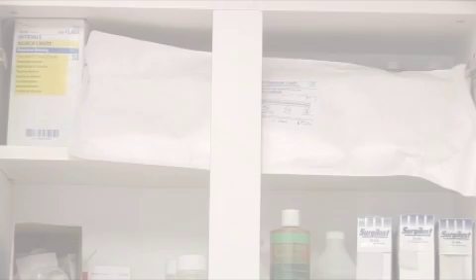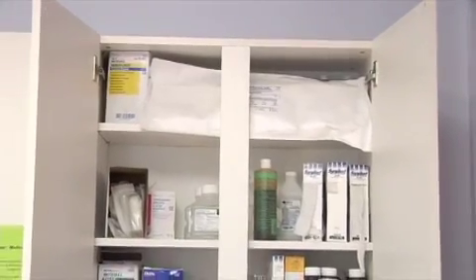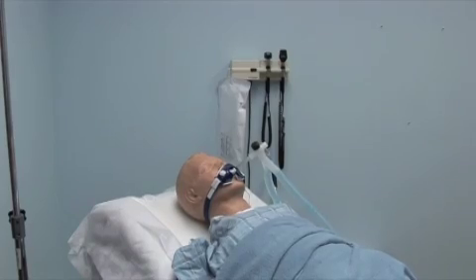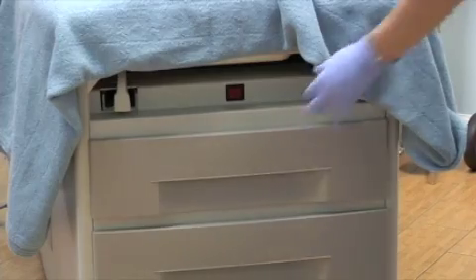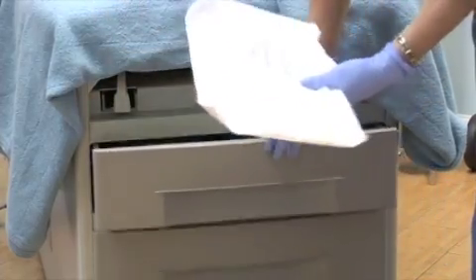New, unused Cam Rescue Caths should be stored in a cool, dry place close to where endotracheally intubated, mechanically ventilated patients are. When stored in the patient's room, this may include a wall cabinet used for emergency supplies, or an individual catheter may be attached to the wall or to the ventilator with a clamp or hook that does not penetrate the sterile areas of the package. It may also be stored in a properly labeled drawer of a code cart or difficult airway cart.